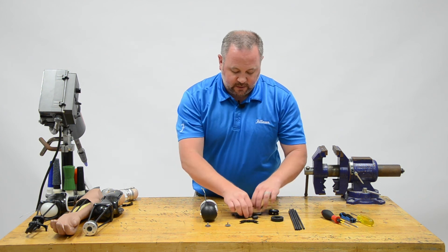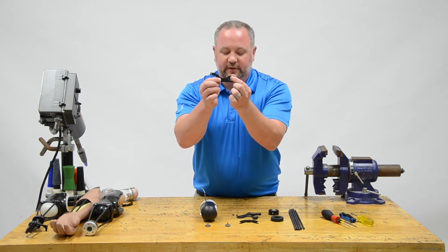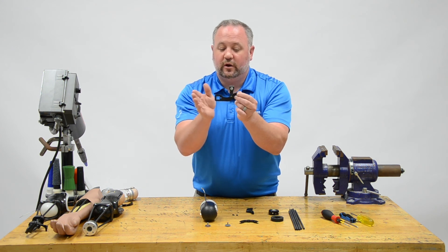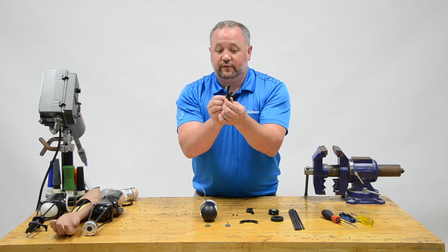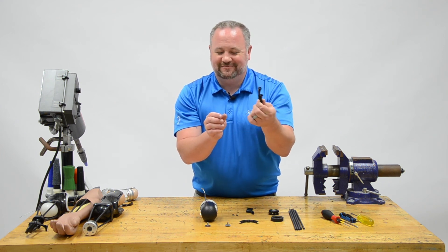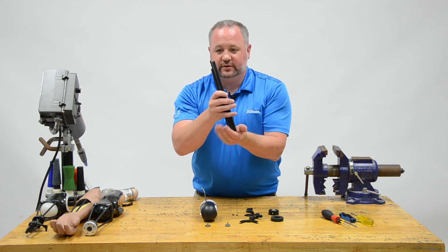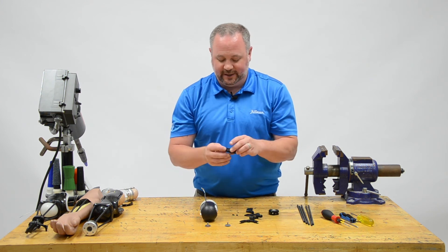With your Nexo kit, you're going to get these little uprights — two of them, a left and a right. There's going to be a small lift tab made of Santoprene to put on whichever side you need for the patient. I've installed this for a left-sided amputee, so it's on the left upright. You're also going to have five rods, coming at 12 inches, which is way longer than you'll need for any patient.